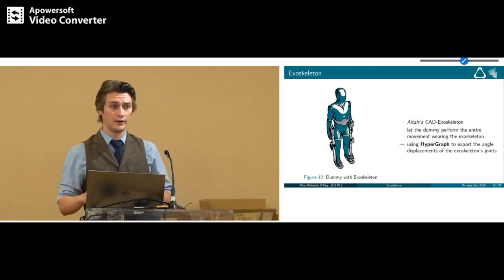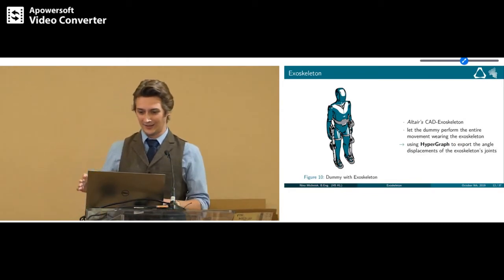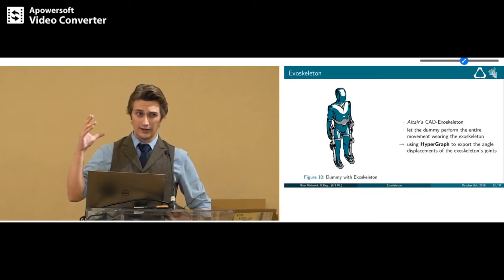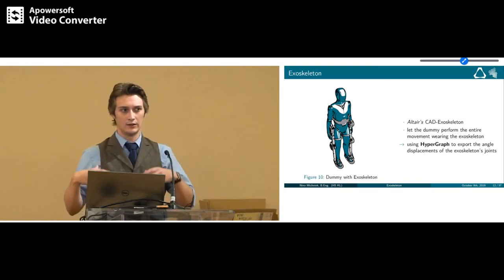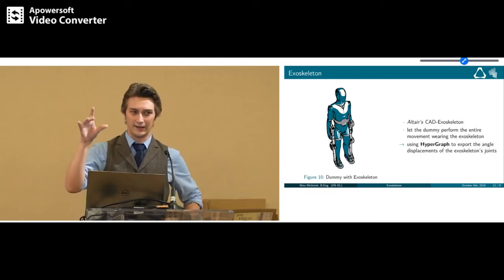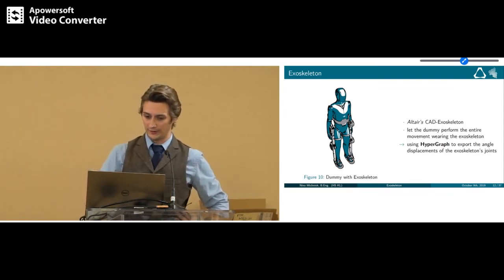So by that point, I had a human dummy performing all the desired tasks, but I didn't have any exoskeleton in it. There were some issues in the beginning, and I received an updated CAD model of it by that time. And the idea was now to fit the human dummy into the exoskeleton, let it perform its entire movement again, and use hypergraph to read the angle displacements of the exoskeleton joints to use them later to actuate the exoskeleton instead of the human dummy joints.